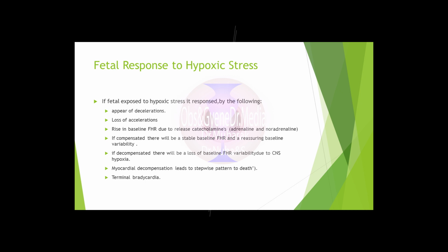This is termed deceleration. If this reflex response to hypoxic stress is insufficient to maintain oxygenation of the central organs, brain, heart, and adrenal glands, the fetus would conserve non-essential activity by stopping movements, leading to a loss of accelerations in the cardiotocograph trace.